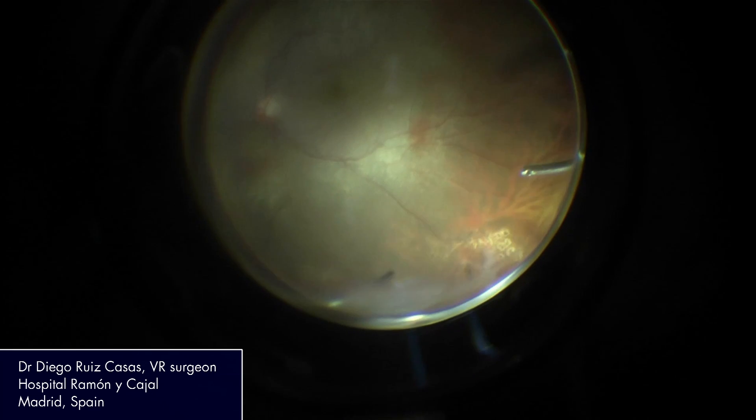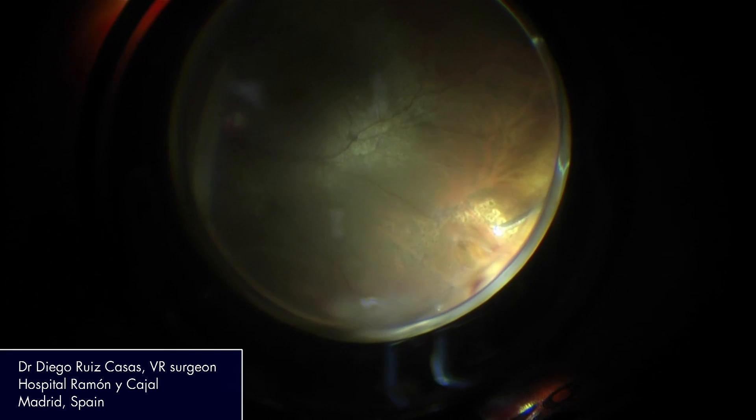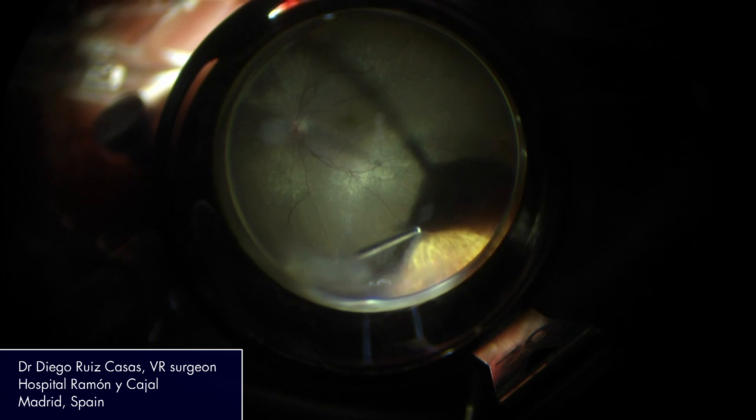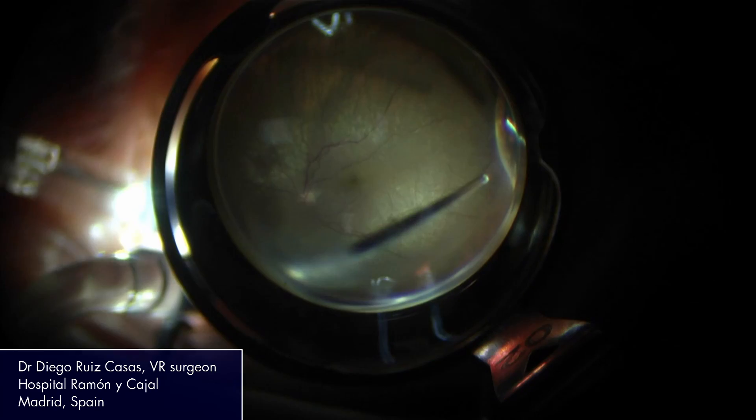It's a really fast pump like venturi pumps, and it also allows you to control the flow like peristaltic pumps, but without the drawbacks of peristaltic pumps — like the flow pulsation due to the compression of the tubing. That way you can perform central vitrectomy in vacuum mode, detach the vitreous in vacuum mode, perform really safe vitreous shaving under low flow mode, and then change again to high vacuum or high flow to perform anterior vitreous base dissection.